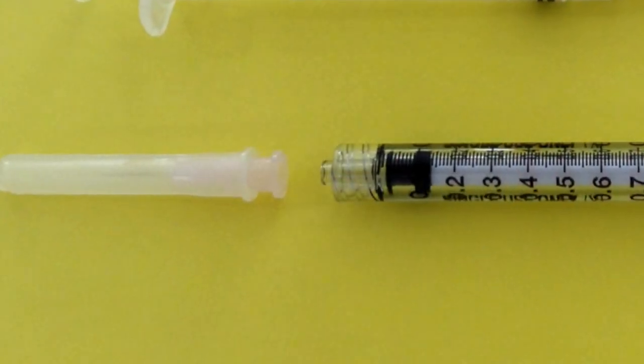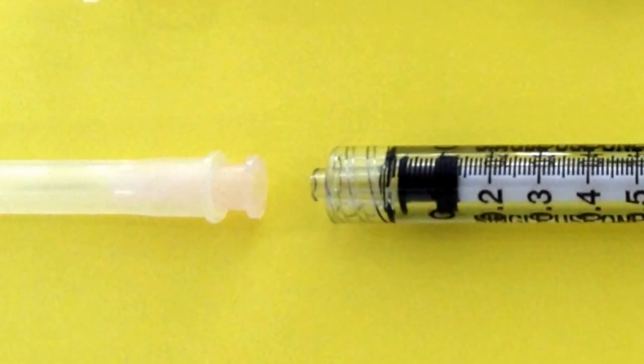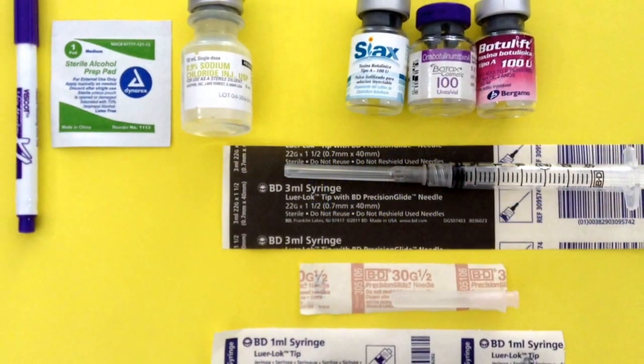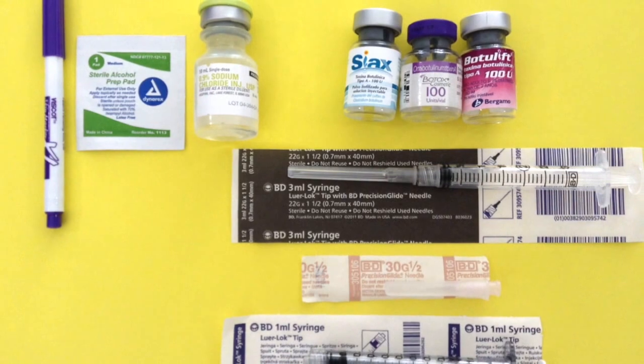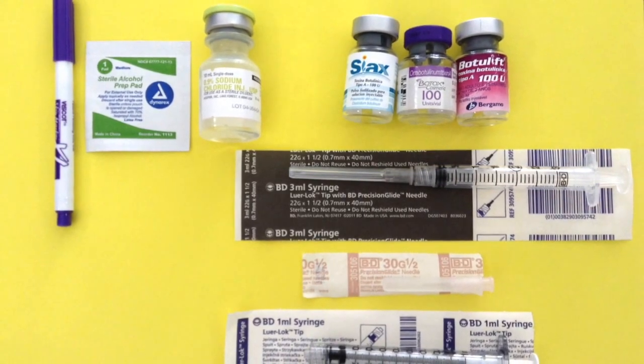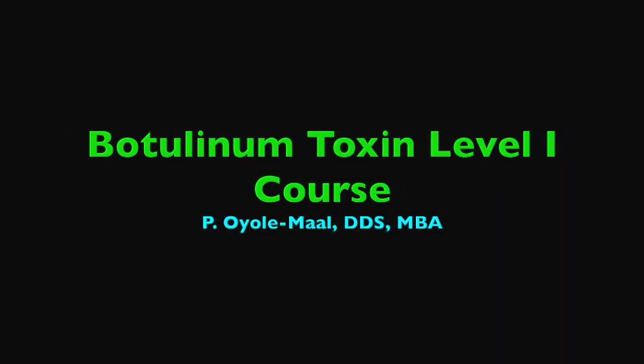Luer lock syringes can be attached to this needle to aspirate the volume you need. The needles for application should be between 29 and 32 gauge and half inch long. Make sure you understand the toxin unit system well before moving forward and good work.